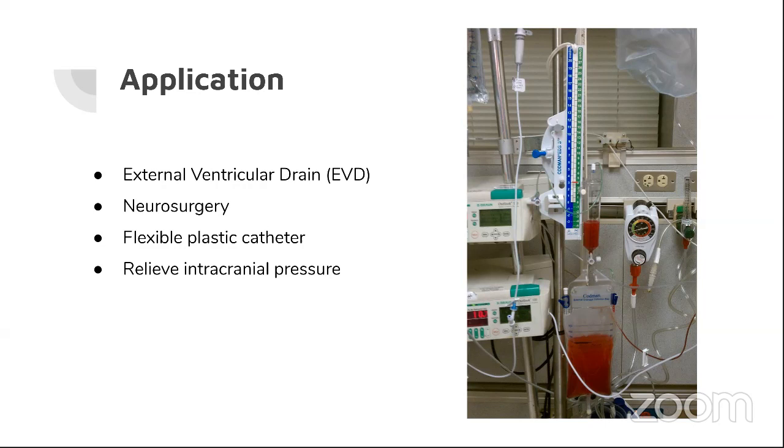So let me introduce EVD. EVD, also called external ventricular drain. As you can see in the picture here, it is a neurosurgery that places a flexible plastic catheter, which reduces the intracranial pressure by draining the fluid from the ventricles when the normal flow of fluid inside the brain is obstructed. By making an automatic MRI segmenter, this project is beneficial for enhancing the operability and accuracy of EVD. Next, I will talk about data collection.